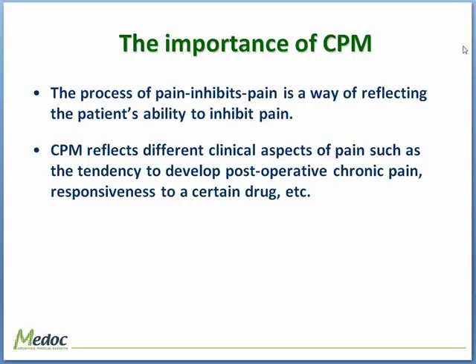and if they do have chronic pain, the intensity is lower than in the patients that are, like, a healthy subject. They are more pain-free, but for some reason had less capability to inhibit experimental pain. We talk in an experimental setting. Again, it's very important, because using experimental pain that's easy to run, to apply, to measure, you can predict or somehow make some impression which patients are going to suffer more.